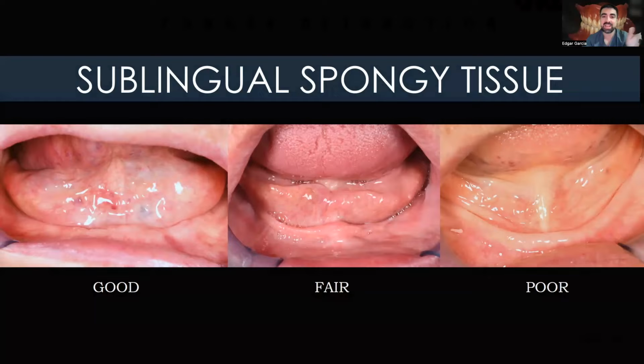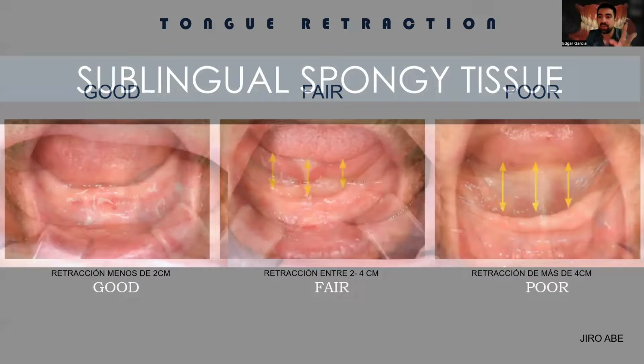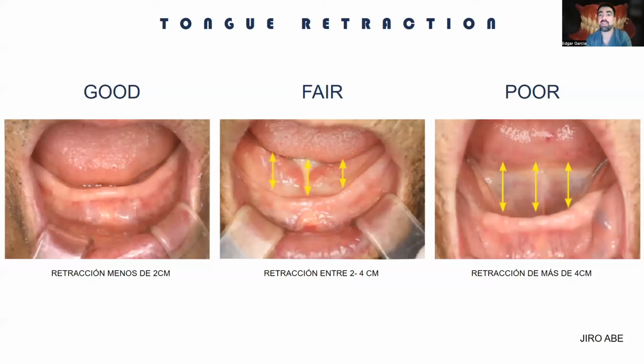Also, we can talk about the retraction of the tongue. When a patient retracts the tongue more than 4 centimeters, it's going to be easier for them to break the sealing, and it's not going to have that good retention that we want. But if we have a patient that has a poor amount of spongy lingual tissue and also a huge retraction of the tongue, we can do something about it.